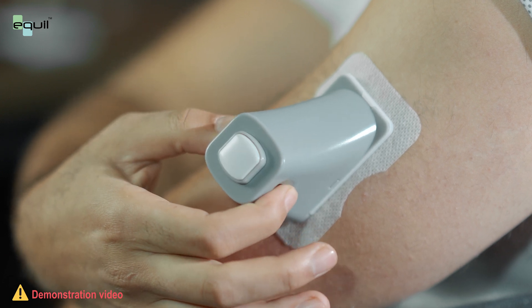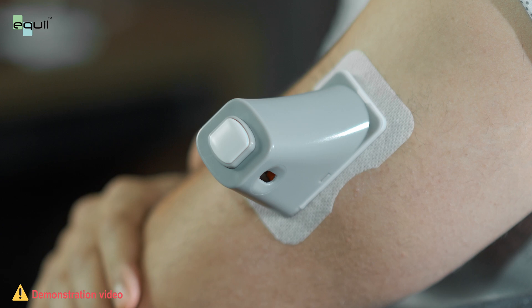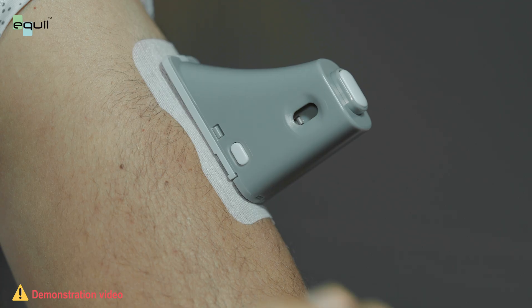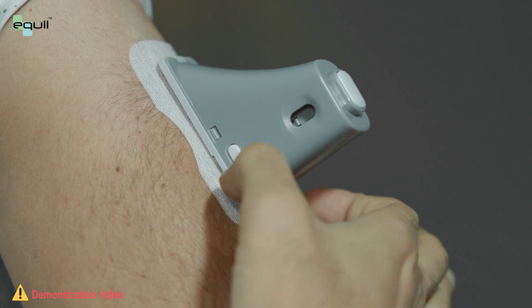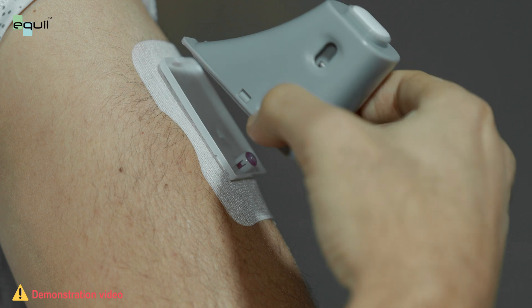Then, the canula will be inserted into the base and infusion site. Thereafter, we can release the inserter from the pump base by pressing the button on the lower end of the canula inserter, then lifting it up.